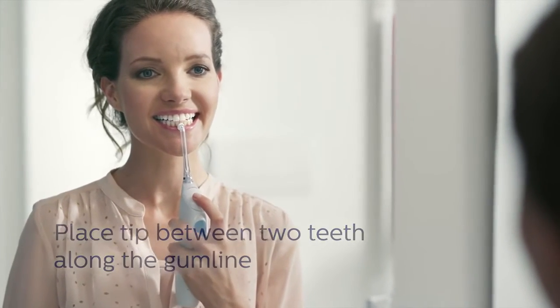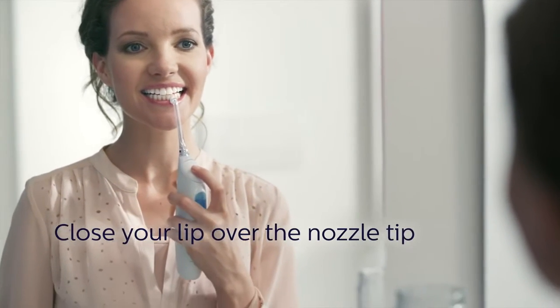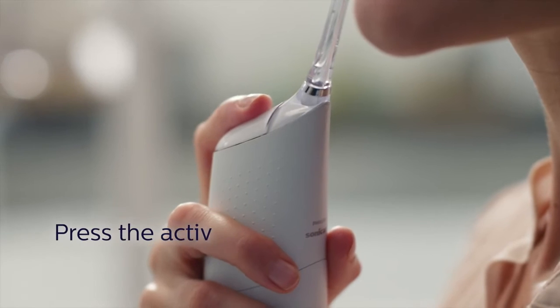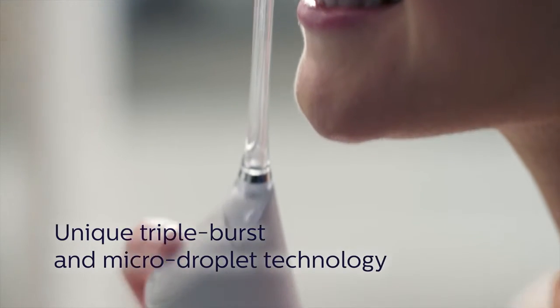Then, place the tip between two teeth along the gum line and softly close your lip over the nozzle tip to avoid any external spray. Press the activation button to deliver a gentle yet powerful triple burst of micro droplets between your teeth.